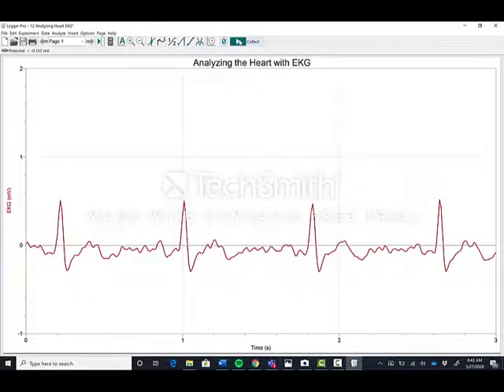Okay, so go ahead and take out the page in your lab that I put on Blackboard and OneNote that I sent to you, and it's got a chart in it, and it has the PR interval, QRS complex, and QT interval. And what we're going to do is fill that in, and I've got my little cursor here.